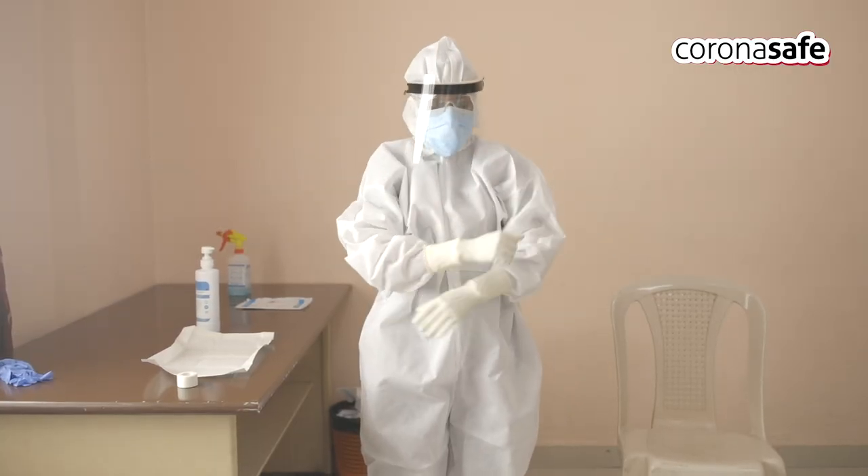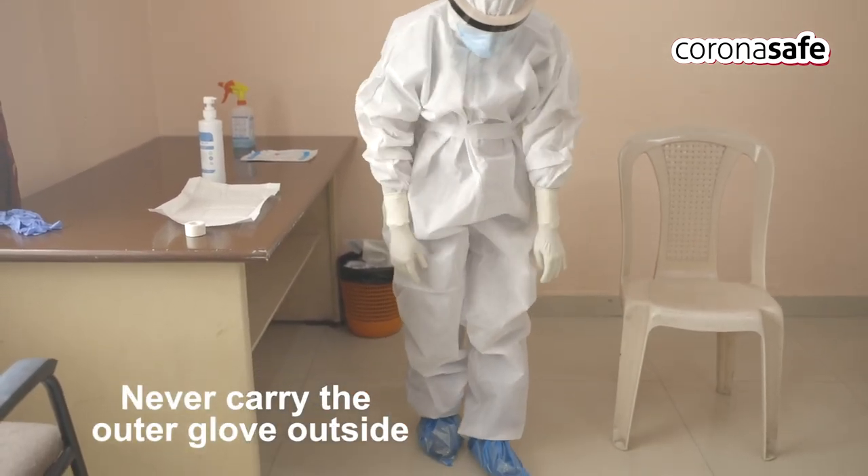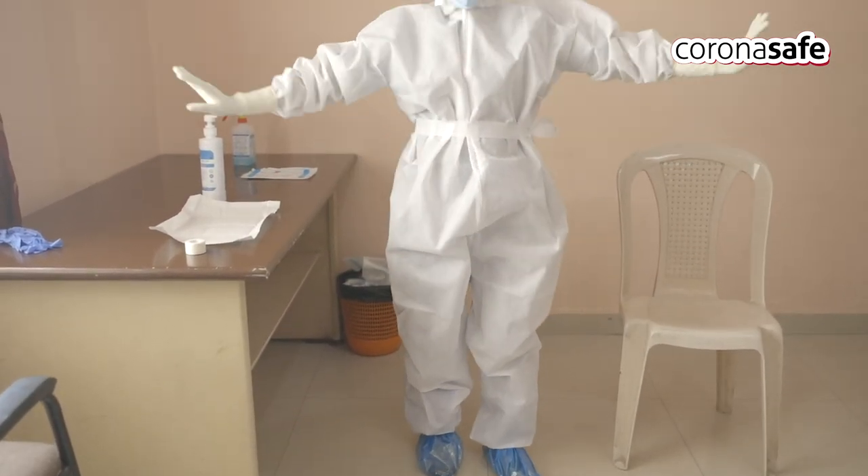After donning all the PPEs, check for any exposure by looking in the wall mirror. Check for all ranges of motion possible after donning.